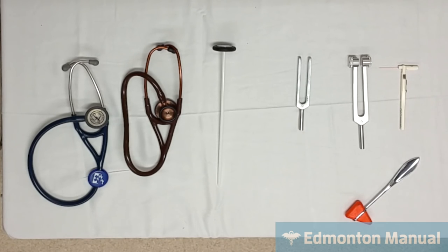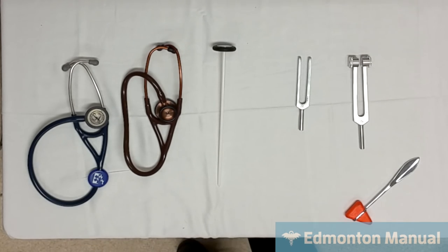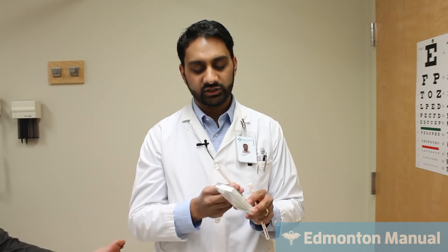Okay. So we're now going to move on to the last thing, which is monofilament testing. And we're actually going to switch patients at this stage. And I'm just going to show you two monofilaments. They're essentially the same. This is a very simple monofilament that can come in a case like this, since you may see something like that, and it's just kept in there.